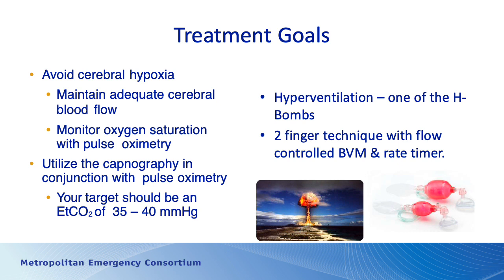I know some people have advocated getting the BVMs that have the little blinky light on it. You compress or squeeze the bag only when the light is lit. As soon as it turns off, you let go of the bag. And our goal, again, is to maintain an end tidal of 35 to 40. And if you have inline capnography in place, you should be able to reach that target.